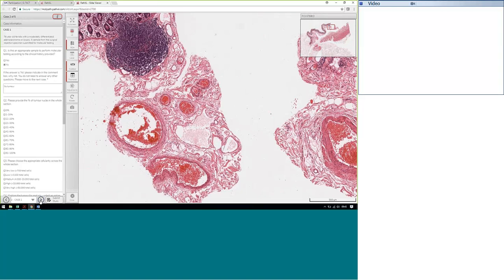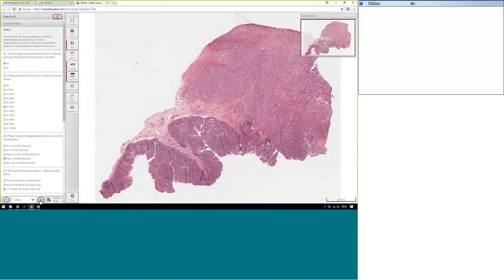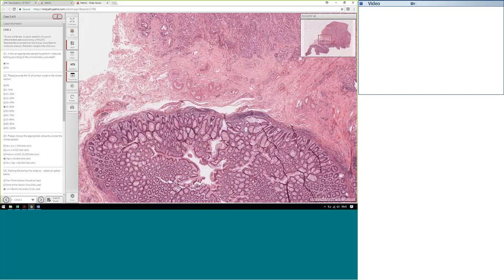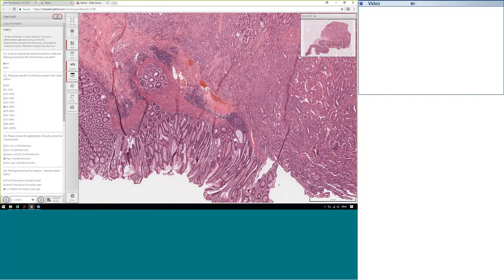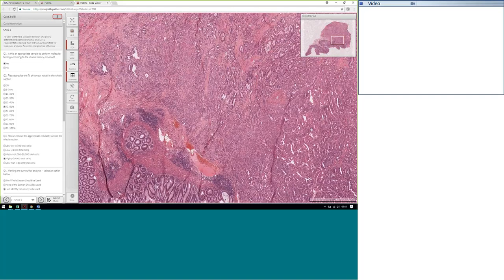Case 2 is a surgical resection of a poorly differentiated adenocarcinoma, PT3N2M1. A representative sample from the tumor was submitted for molecular analysis. On the clinical history, the resection margins were free of tumor, and we can see here a lot of essentially normal mucosa. For annotation purposes, for microdissection, we would be looking to exclude the normal mucosa. In this area we also have a highly inflammatory response, so we would be looking to annotate the bulk of the tumor.